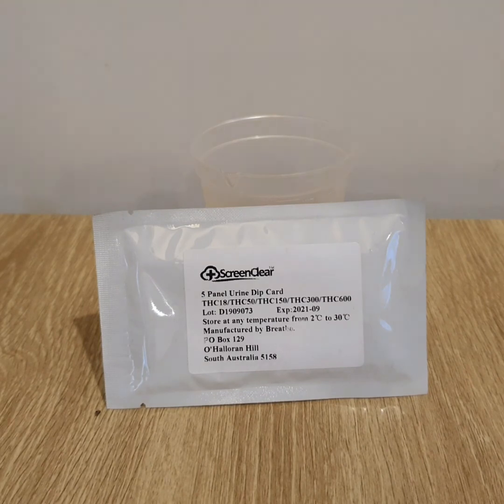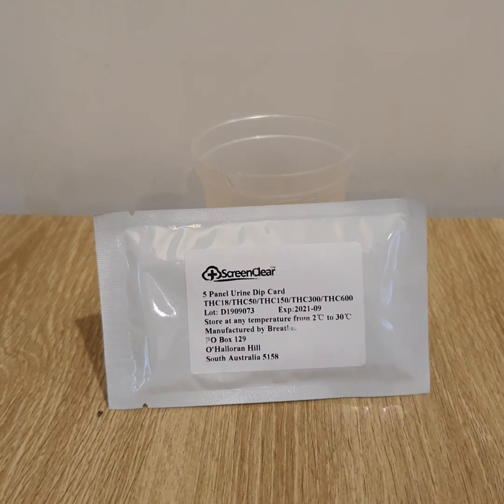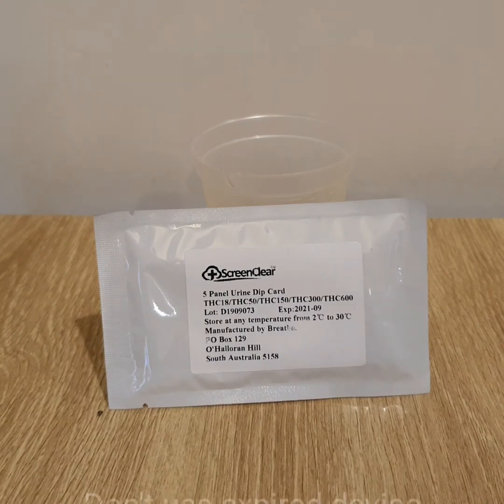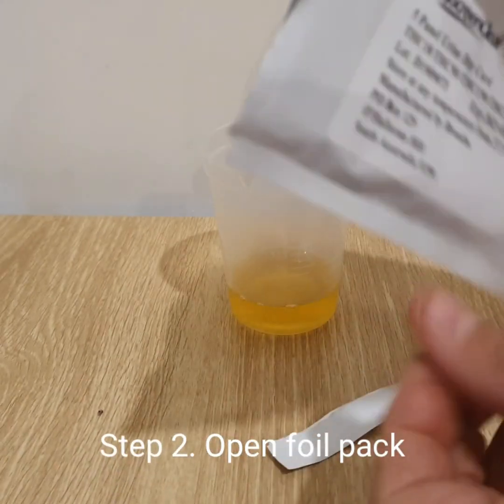In general, drug tests are what they call qualitative — they give you a negative or non-negative result above or below a certain cutoff level. They don't convey exactly the level of chemical in a sample, like a breathalyser for alcohol. This test is different; it will give you more of a quantitative result, more like a breathalyser.